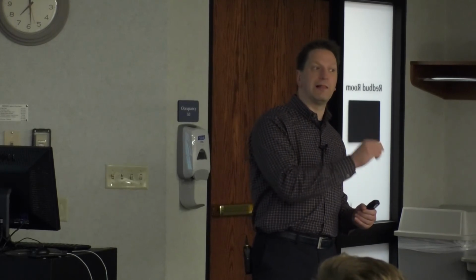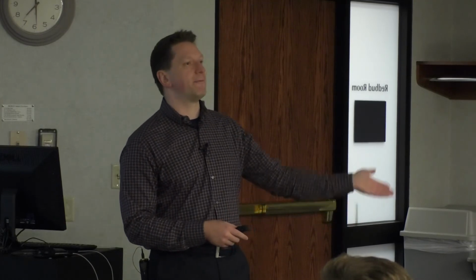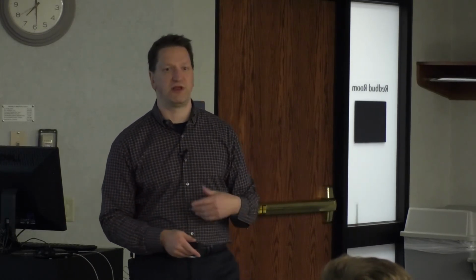Does anybody know? To not capture the T wave. You're very close. We capture the R wave to not capture the T wave. If you shock with a low enough energy, not a high enough energy, a low enough energy on the T wave, you will fibrillate the patient every single time. Okay? Another good reason not to screw around with these low energy shocks. Go for the maximum energy. It has the lowest probability of ever inducing VF. Okay? All right. Very good. Select energy for delivery. See, 125. No, no, no. 360. If you're going to go for gusto.